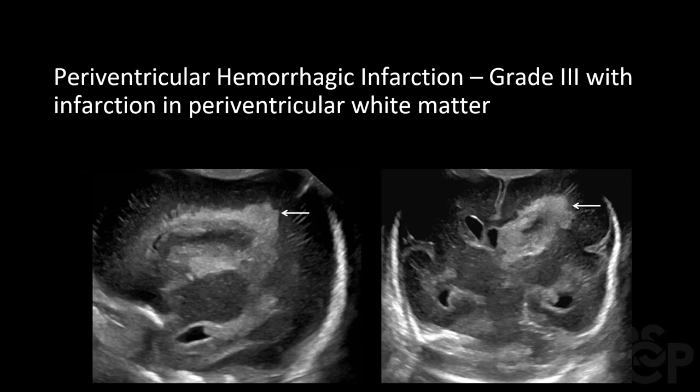What was previously known as grade 4 is now known as periventricular hemorrhagic infarction, or PVHI. This is defined as grade 3 with infarction into the periventricular white matter. In the sagittal view on the left, the arrow clearly shows the infarction extending into white matter, also visible in the coronal view on the right. It was originally thought to be an extension of ventricular hemorrhage, but is now understood to be secondary to venous infarction caused by compression of deep terminal veins by the expanded blood-filled ventricle.